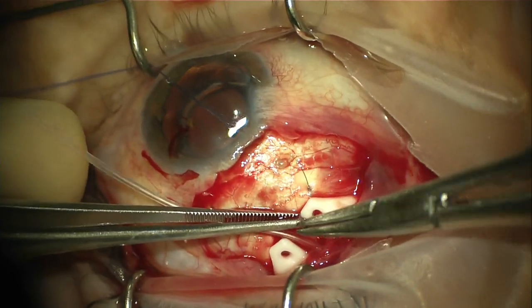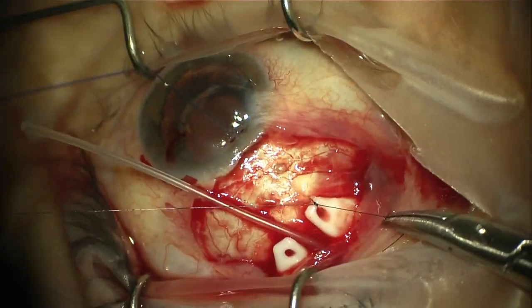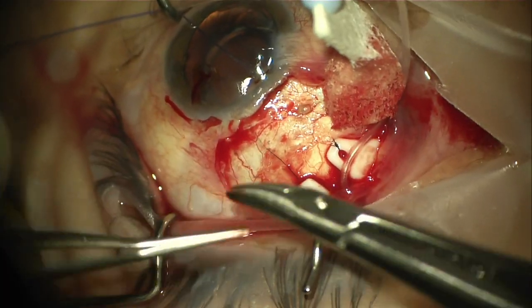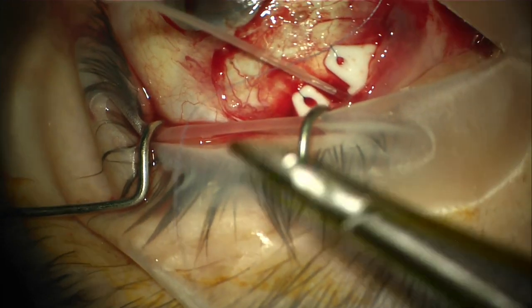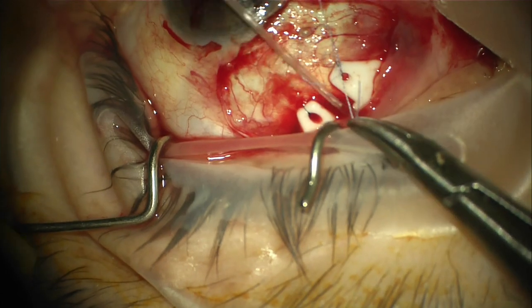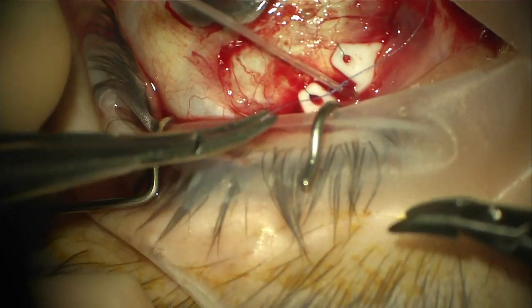The device is anchored to sclera using 8.0 nylon sutures. For many surgeons this is the most difficult portion of the procedure due to the exposure and the posterior placement of the suture holes. However, a major advancement here is the anterior extension of the suture holes and the low profile of the device that allows for ease of fixation.